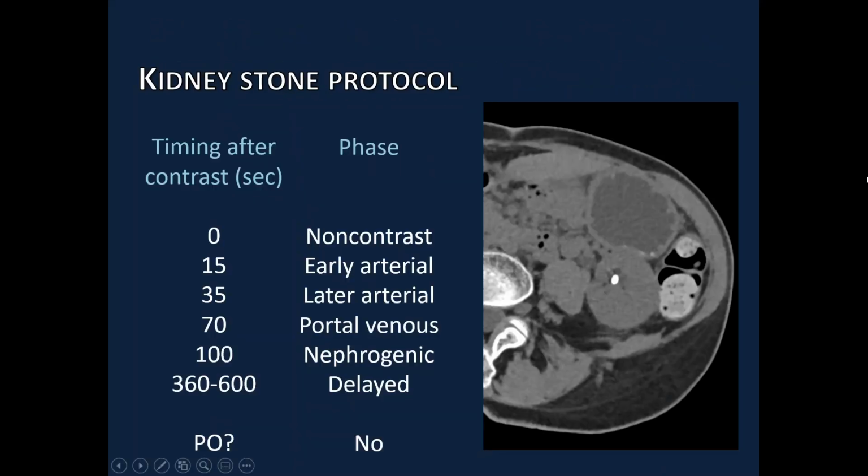Kidney stone protocol is essentially a non-contrast CT. We do not give oral contrast either. And the reason is because stones by themselves are bright, hyperdense, and so any contrast we give is just going to make it more difficult to see them.